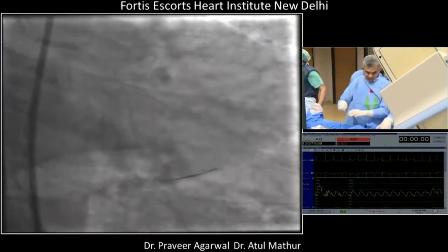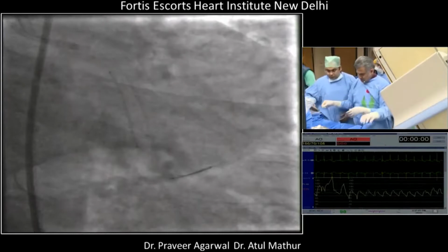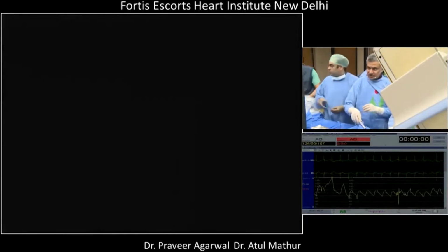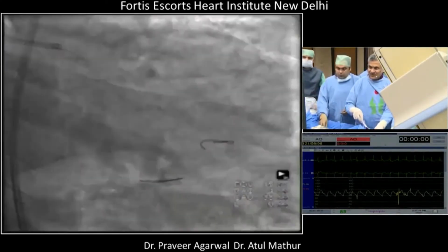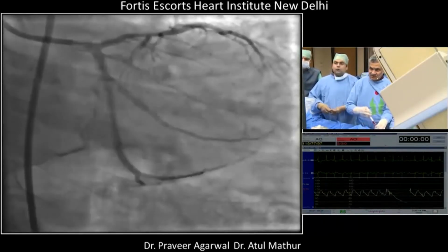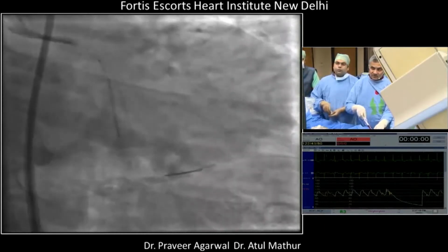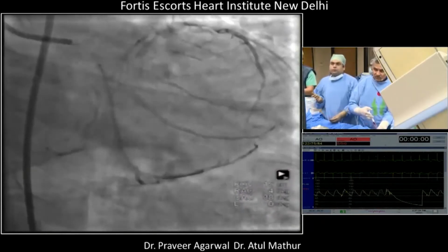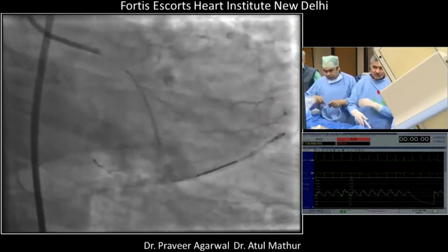So the patient had a little hypotension in the meanwhile. Sufficient enough. Last shot. Can we see the last shot? Take one more. I'll adjust according to. ठीक है? Good. Bit back. Go up. नहीं, पहले देखिए कुछ थोड़ा. Not convinced that we covered the ostium. Yeah, it's fine. Go up.